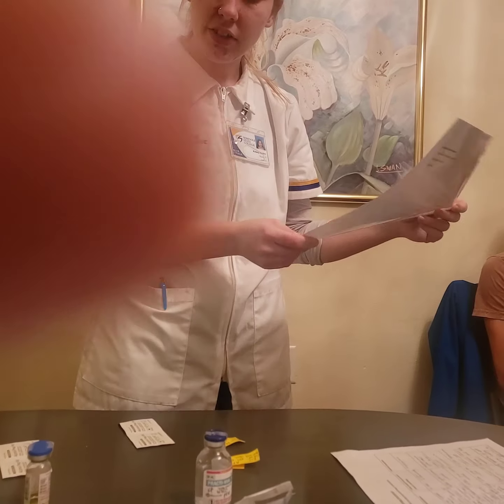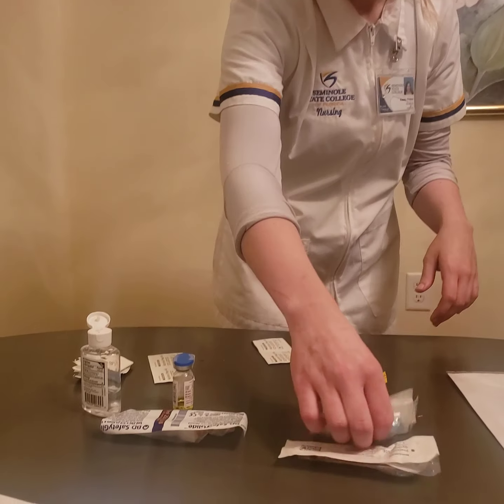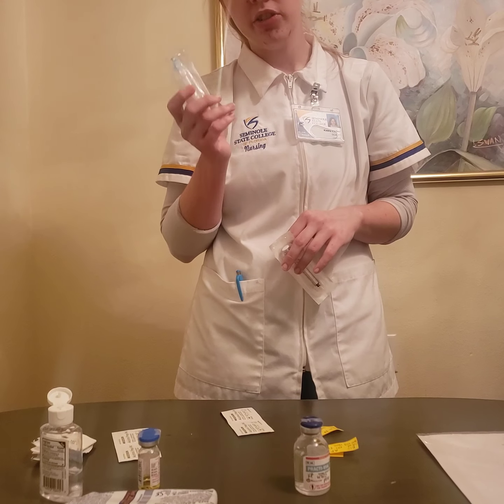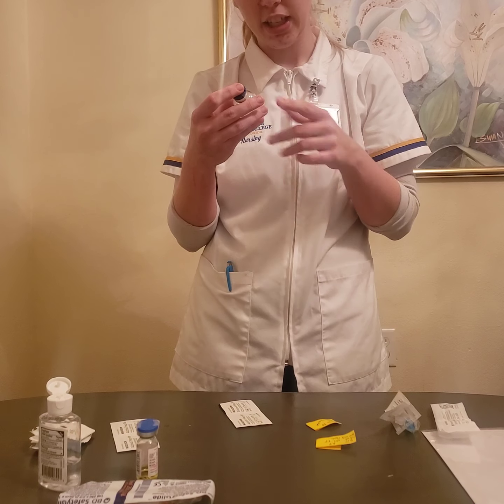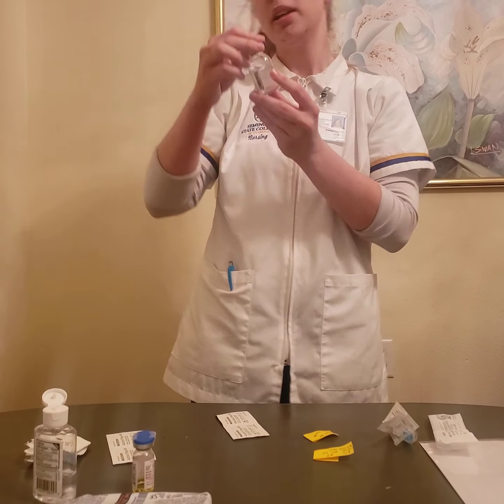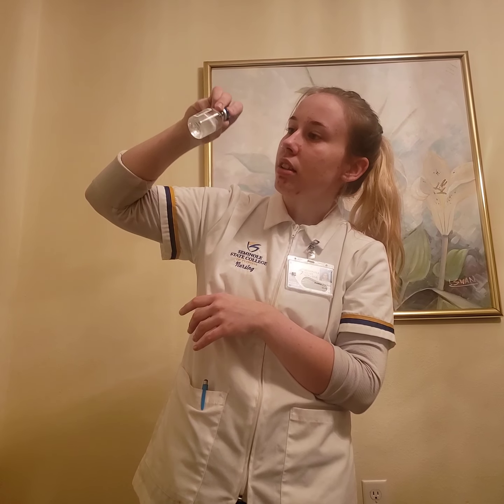I'm going to gather my supplies here. I'm going to start and make sure that I have all of my supplies. I'm going to be using a 1 milliliter syringe with a 23 gauge needle, which is 1 inch long, to do my intramuscular injection, and that is going to be for my flu shot. I do have a multi-dose vial here, and I need to make sure that it's time dated, it's in date, and there are initials for whomever opened it. If I were to open it, I would do those things. And I want to check to make sure it is not expired, there's nothing floating in it.